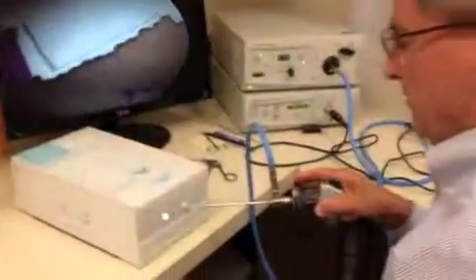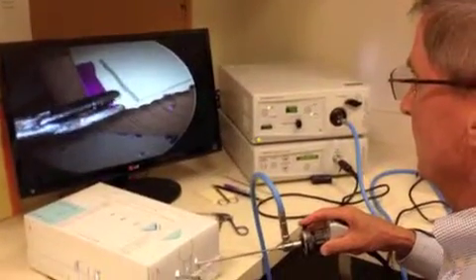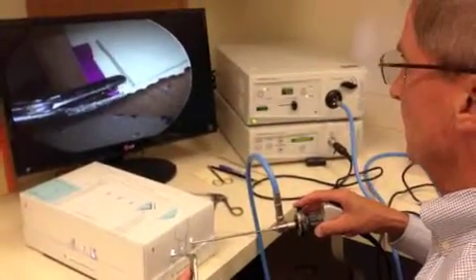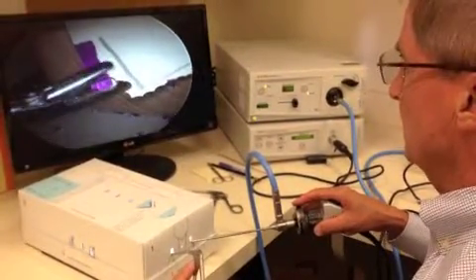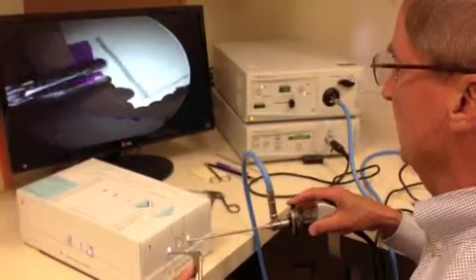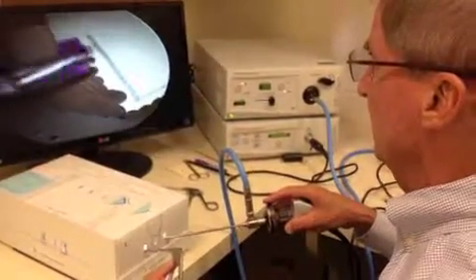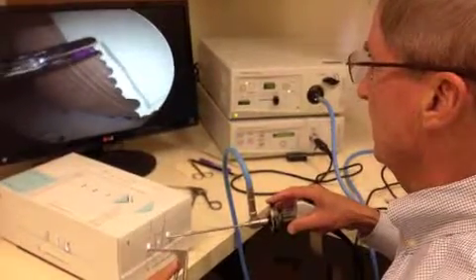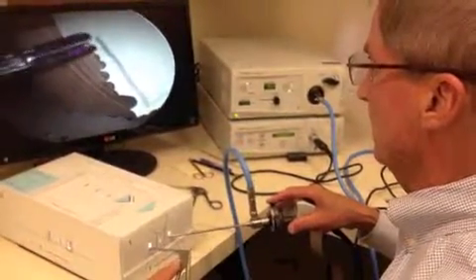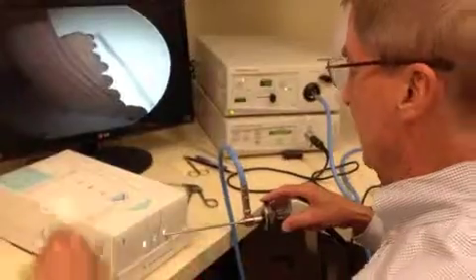Then we switch hands — hammer in the right hand, punch in the left hand — getting rid of the blue line and leaving the pencil line. We're not giving points for how deep that is; just resect the blue line and leave the pencil line. That's task number one.